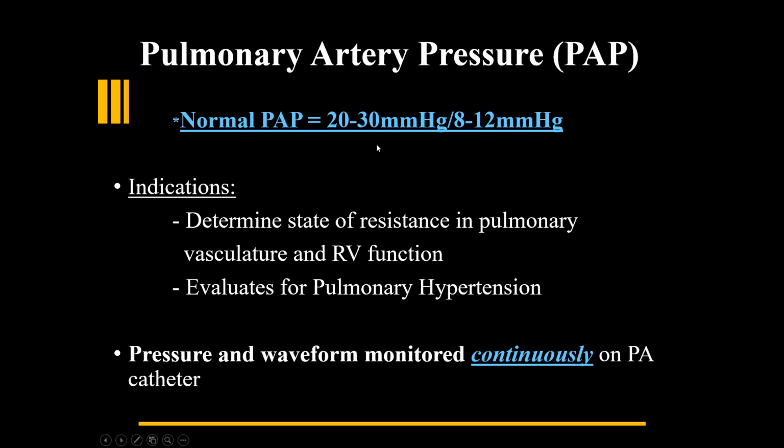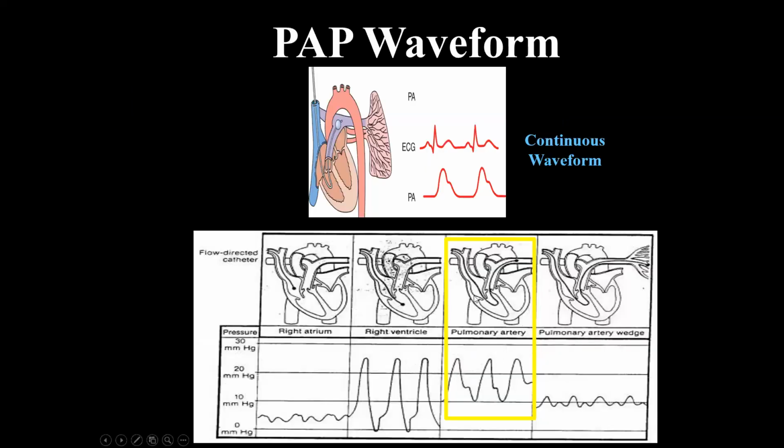You're gonna see really, really high pulmonary artery pressure numbers, okay? This is something I can walk into the room, look up at the monitor, and absolutely 100% see that waveform. I don't have to do anything. It's continuously reading on the monitor. So that's a beautiful thing. So that's this one right here.